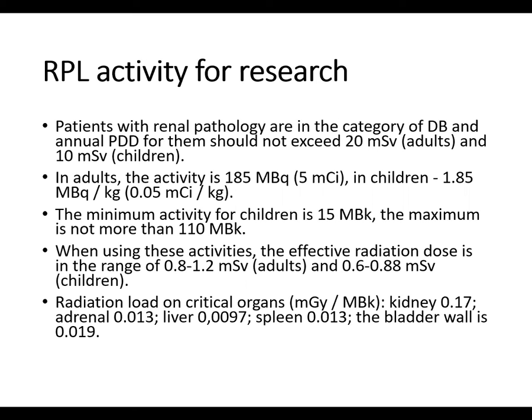In adults, the activity is 185 megabecquerels, which is 5 millicurie. In children, 1.85 megabecquerels per kilogram, which reflects the radioactivity which is introduced into the patient's body.